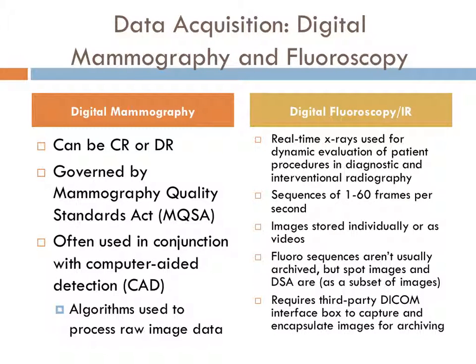All right. We're just going to talk a little bit about digital mammography and fluoroscopy as far as data acquisition goes. So for digital mammo, either CR or DR is used today. Film based has gone by the wayside. Mammography is governed by the Mammography Quality Standards Act, which is MQSA. It is often used in conjunction with computer-aided detection, or CAD. CAD basically uses algorithms used to process the raw image data.